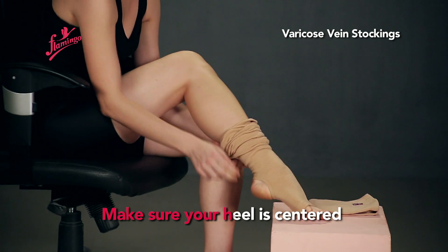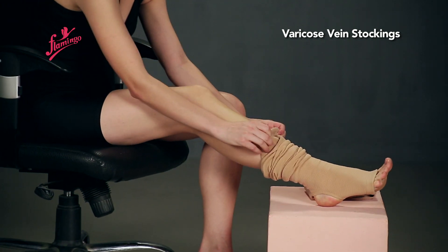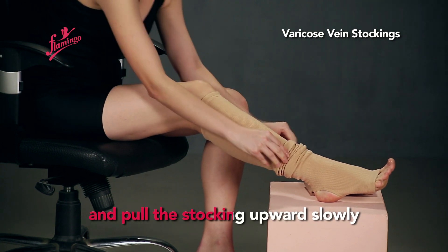Make sure your heel is centered on the heel opening, and pull the stocking upward slowly.